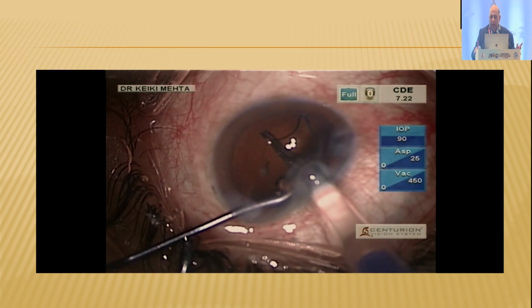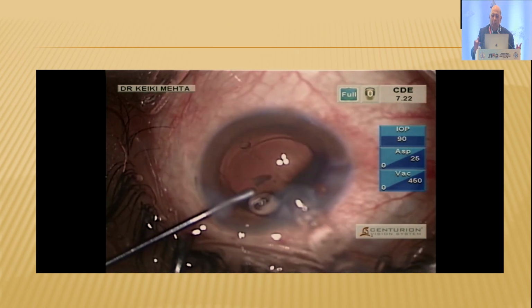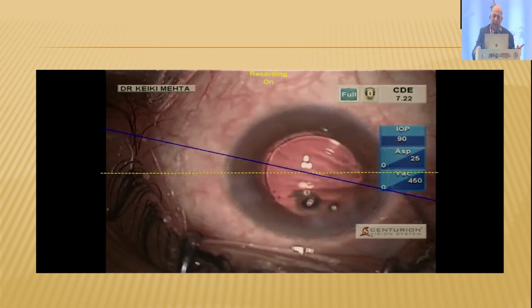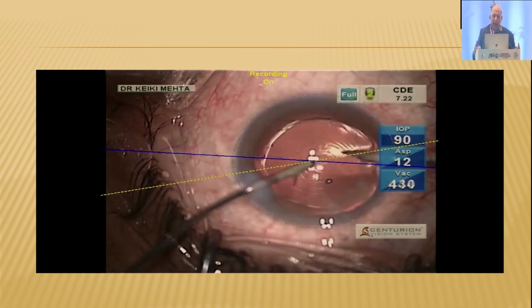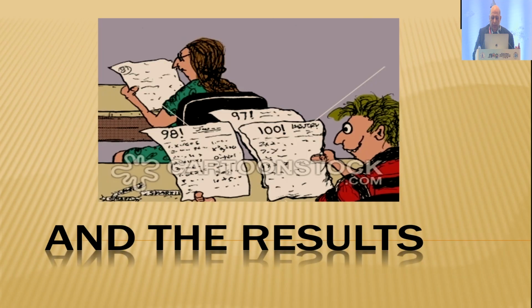The most important thing of all is, remember, after you put your lens and have positioned it, to press on the lens and remove the excess viscoelastic from behind. Either you can press it manually or you can inject a little air and let the air press it for you. Because very often, if a lens rotates, it rotates because of viscoelastic which you left residual behind the lens.